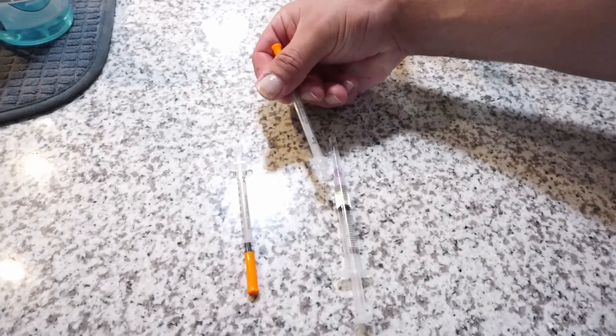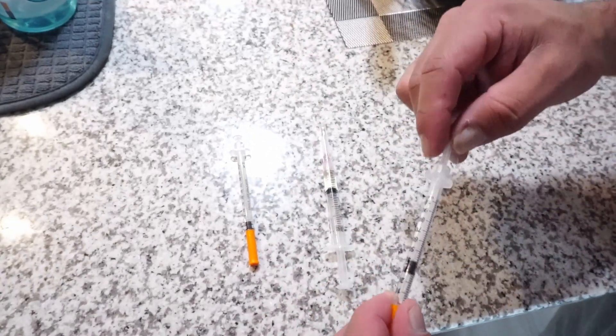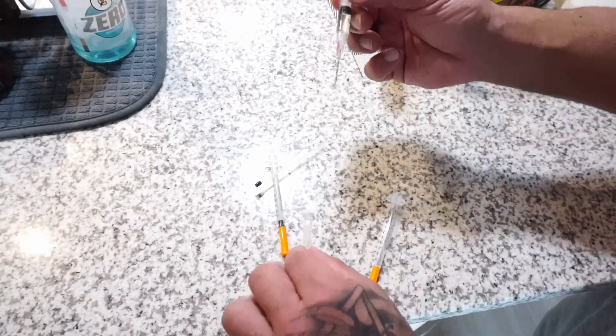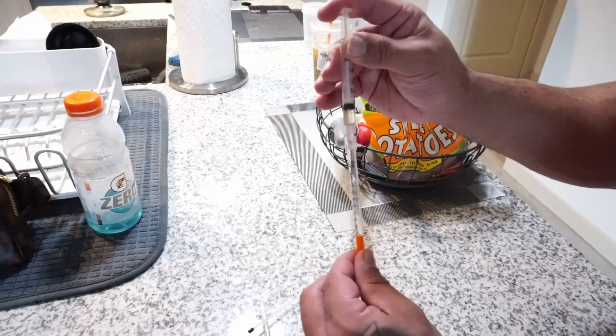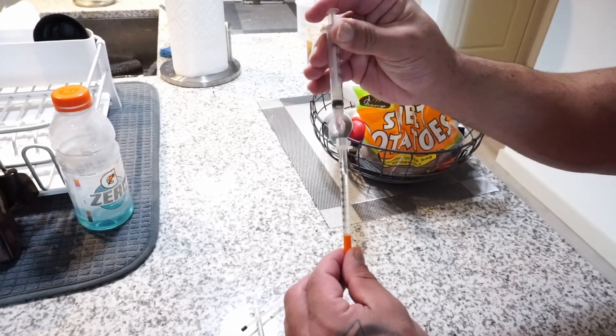What's up guys, today we're going to show you how to backload an insulin needle when shooting testosterone. I got a syringe here full of test. This is the insulin syringe we're gonna use — brand new. Make sure you clean it. You're gonna pull this, take the cap off, and load the syringe this way. Shoot all the oil in it — you see it?